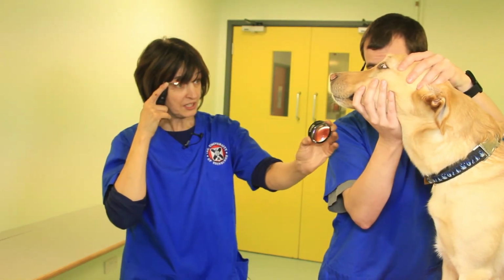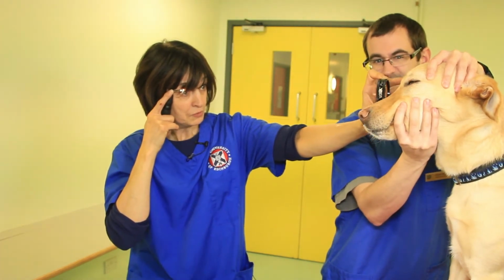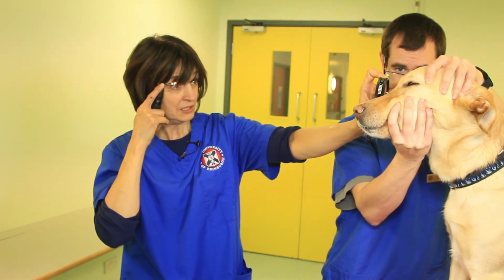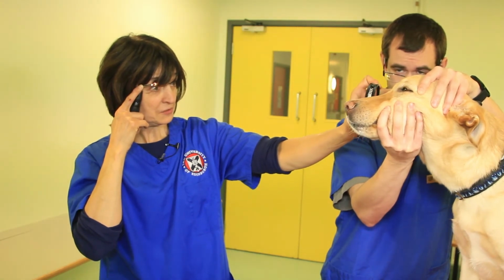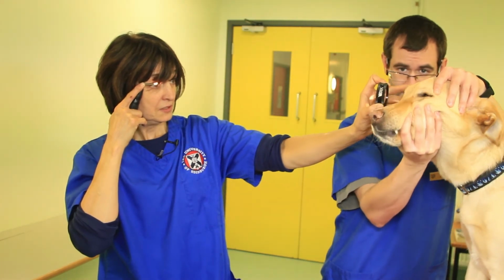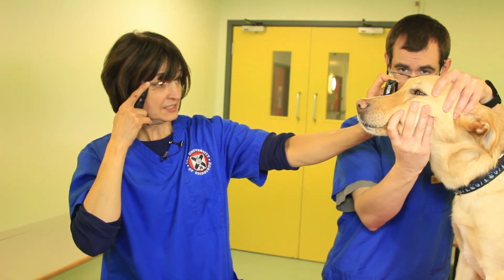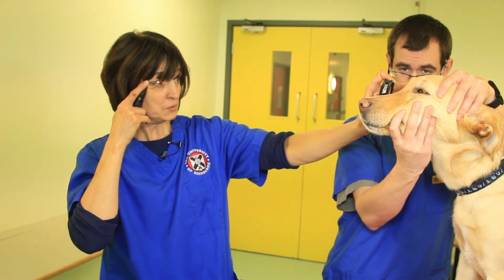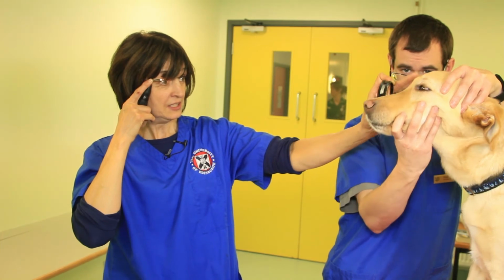I then bring the hand lens close to his eye. That will focus the light on the back of his eye and becomes really quite bright for him, but at the moment I can see a really nice view of his fundus. And just by adjusting how far away the lens is from the eyelids, I can get the fundic image to fill the lens. If the lens is too close to the dog like that, I see lids and iris in the image. If I gently pull the lens back towards me without changing anything else, I will see just the fundic detail in the hand lens.